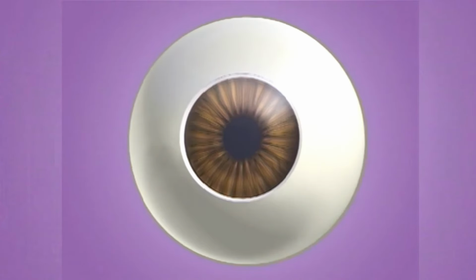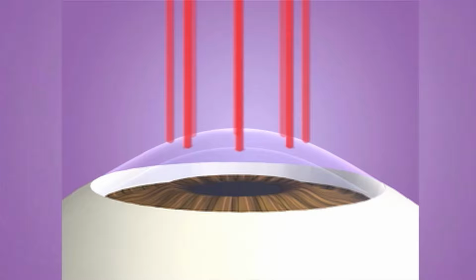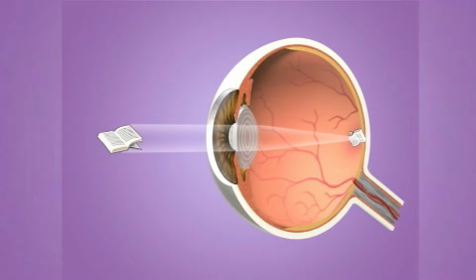Unlike other refractive procedures that must be performed in a sterile environment, LTK can be safely performed in a doctor's examination room. A computer-controlled laser is focused on multiple points around the cornea. This area is outside the center of the cornea, where light rays enter the eye. The heat of the laser causes the peripheral cornea to tighten, making the central cornea steeper. As a result, light rays are then focused directly onto the retina.